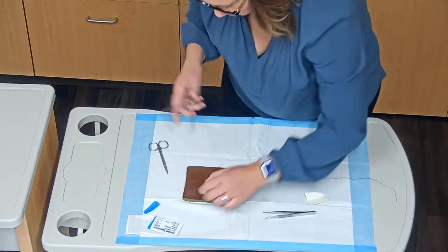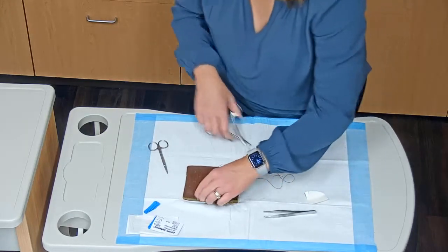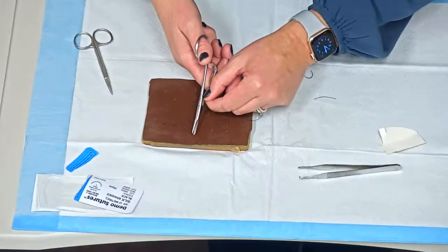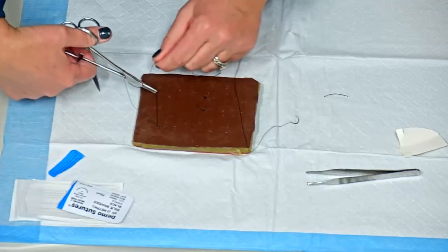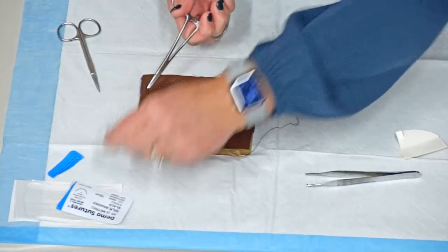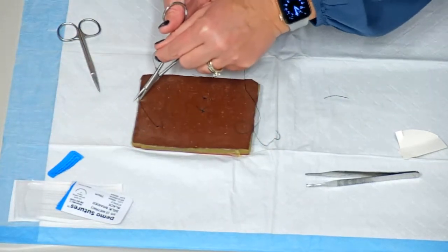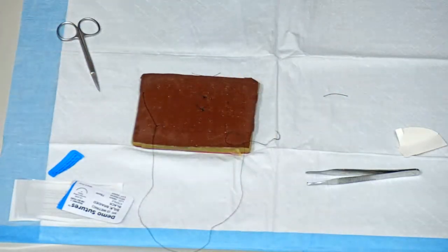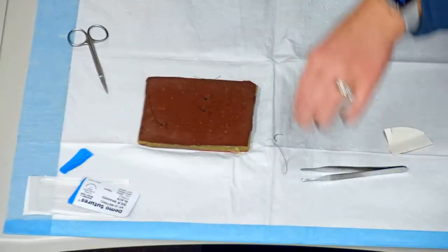You're going to let go, pull through again. You're going to tie off very much in the same manner that you did with your simple interrupted. So 2, you should be starting to get the hang of this. Grab the tail, back towards me. 3, 4, now, in order to do a running suture, we are not going to cut this. We're going to do a continuous suture.